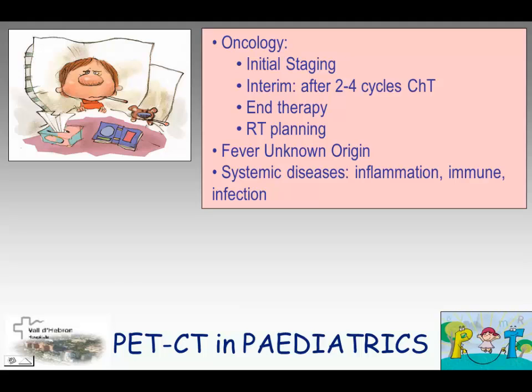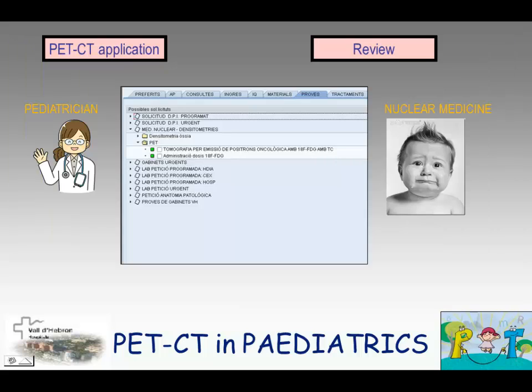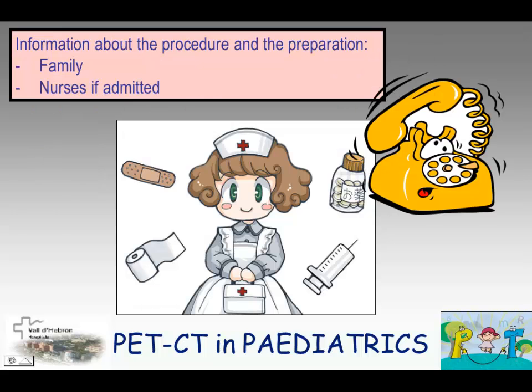What about the appointment? The pediatrician or the oncologist has to send us a request to perform the study, and we have to review this request in order to know if the indication is correct. And we have to inform about the procedure and the preparation to the family if it is an outpatient, or to the nurses if the child is admitted in the hospital.